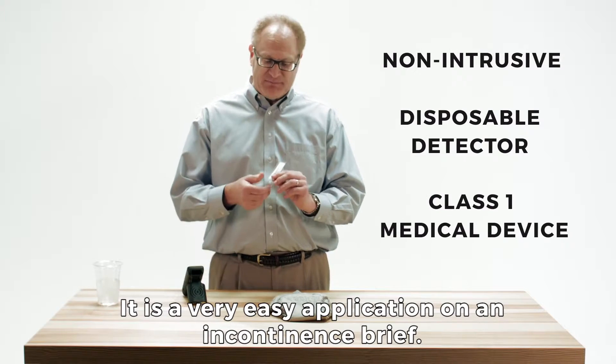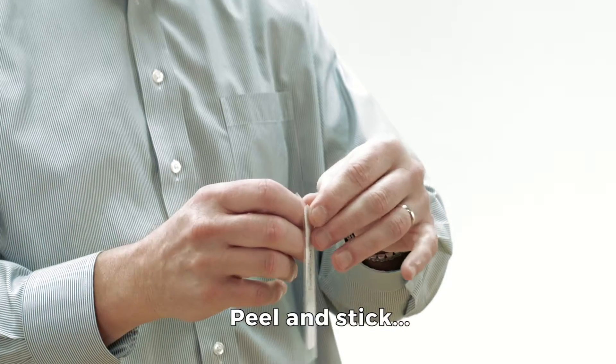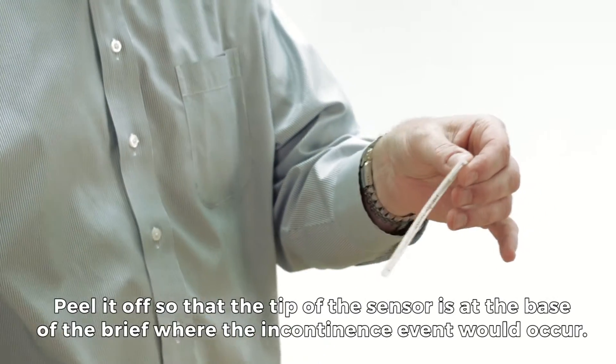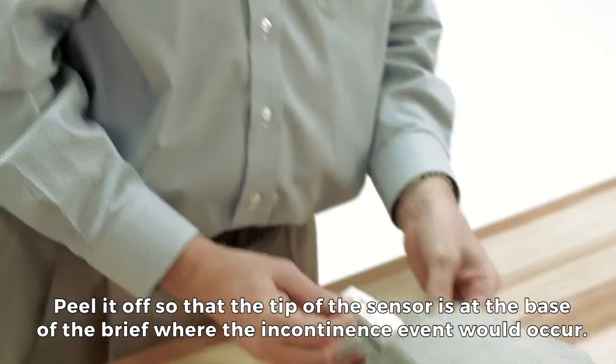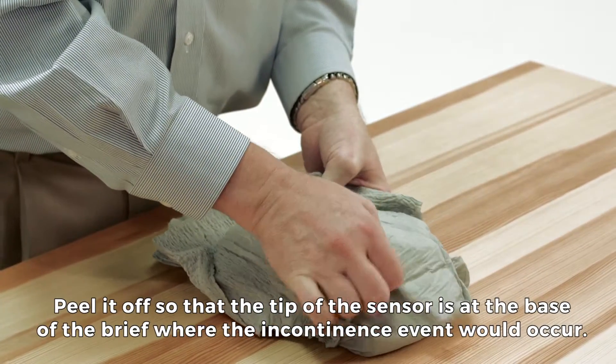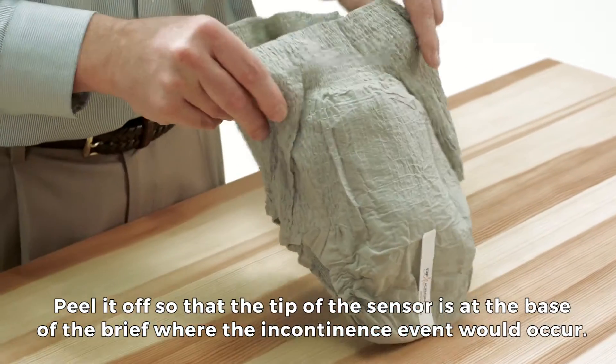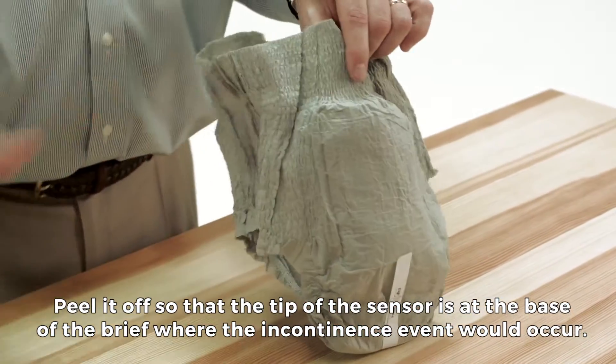It's a very easy application of the detector on an incontinence brief. You just peel and stick — peel it off and place it on the brief such that the tip of the sensor is at the base of the brief, where the incontinence event moisture would be applied.